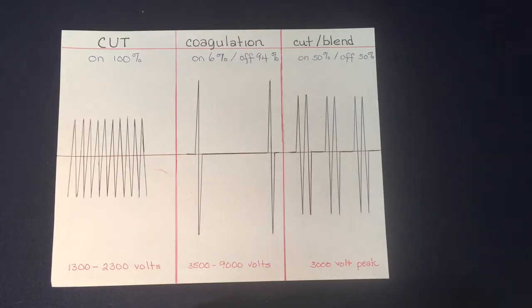You can put blend and add that to it, and what you're doing is adding some coag to it. We used to have ones that had blend one, two, and three on it, so depending on which setting, one would have the least amount of coag added to the cut and three would have the most.